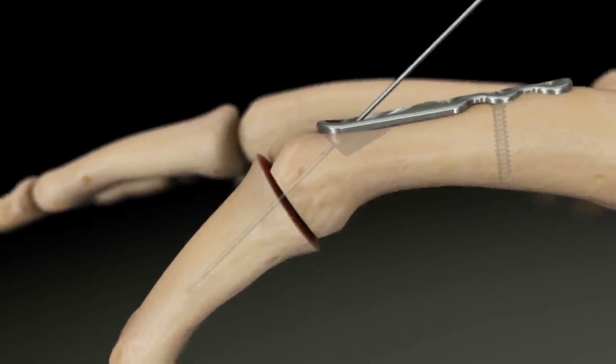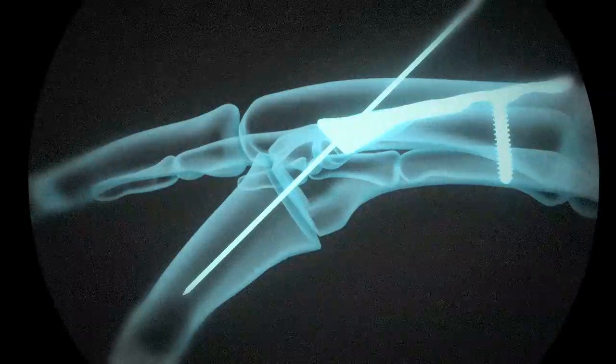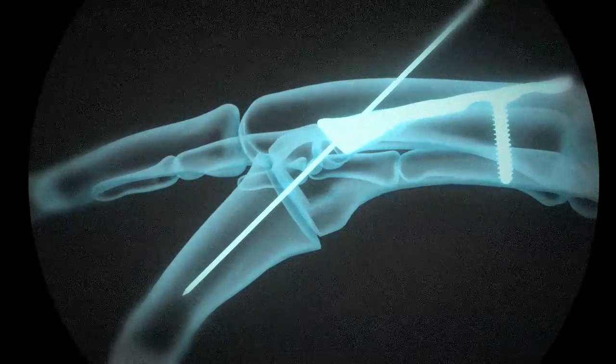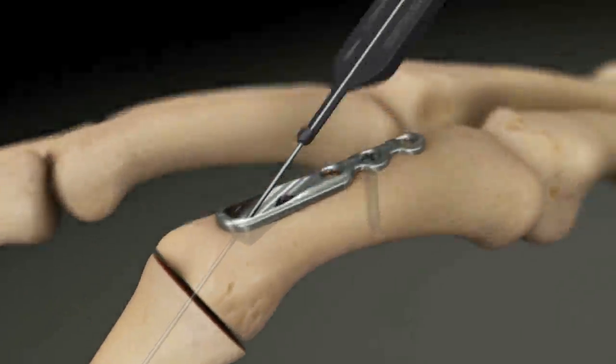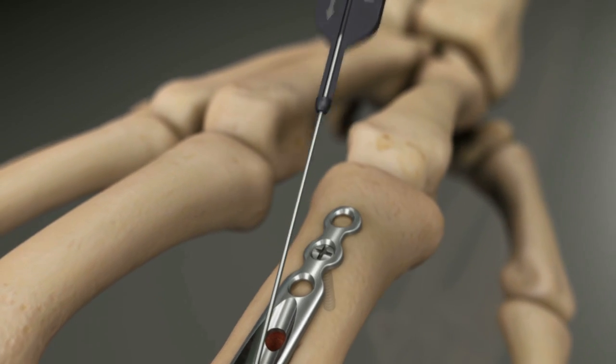Insert a 0.035 K-wire across the joint. Check the angle, positioning, and K-wire depth under fluoroscopy. Measure for the fusion screw by sliding the cannulated depth gauge over the K-wire until the tip reaches the plate.